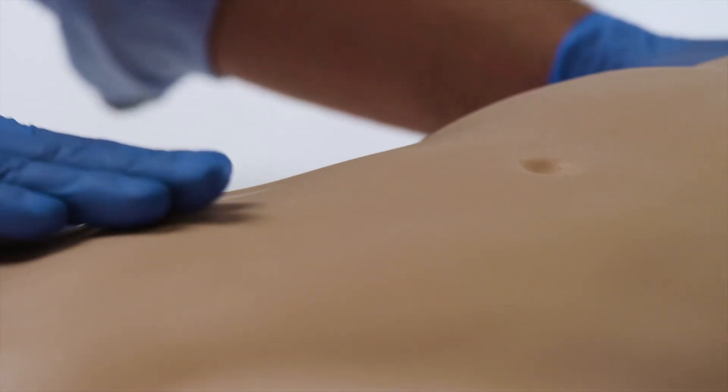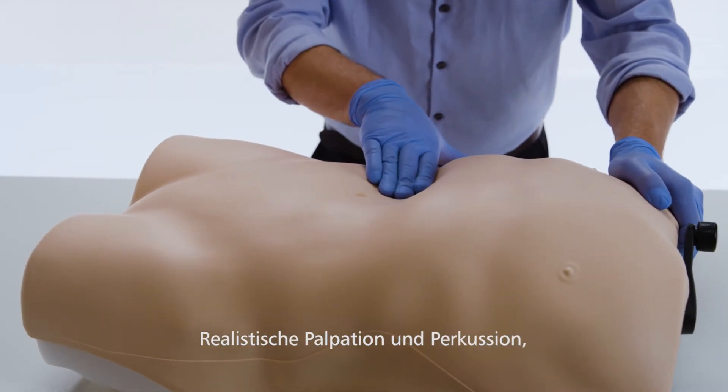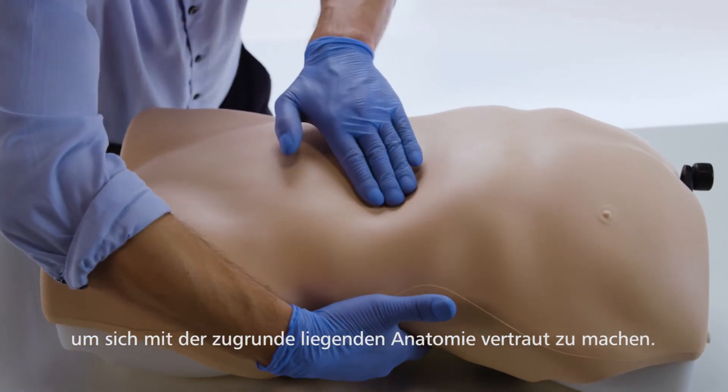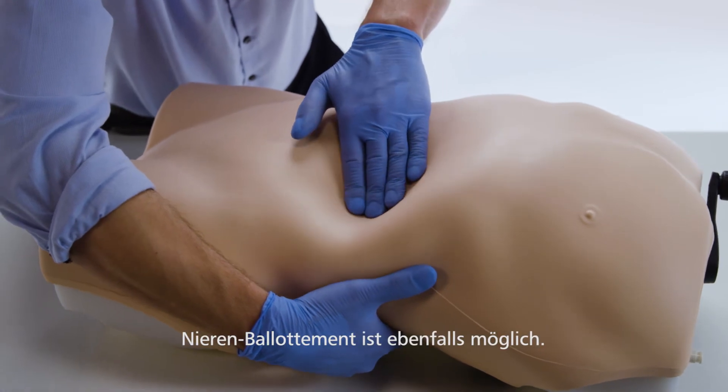The enlarged organs feel realistic on palpation and respond appropriately to percussion, allowing trainees to become familiar with abdominal regions and underlying anatomy. Ballottement of the kidney is also featured.